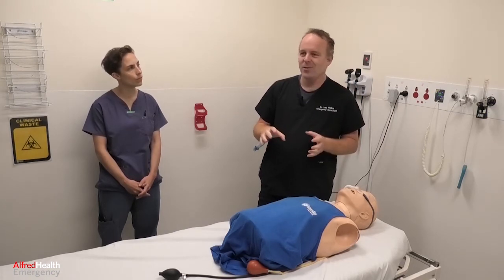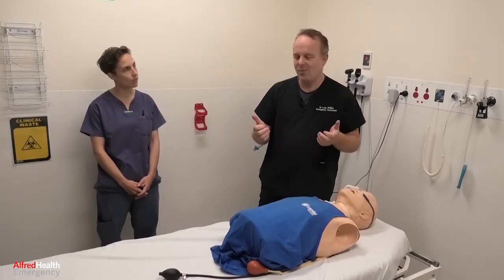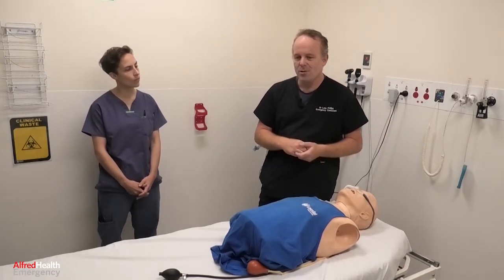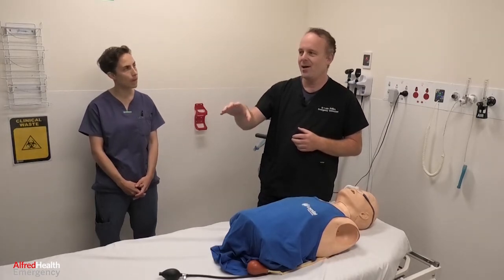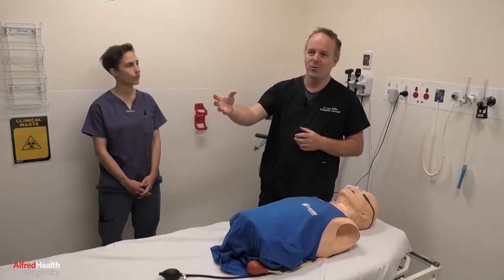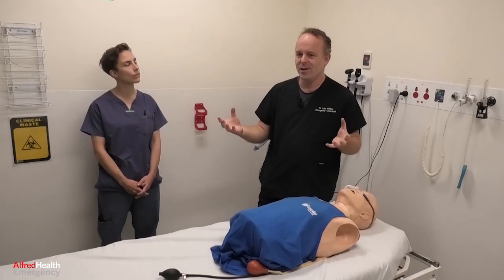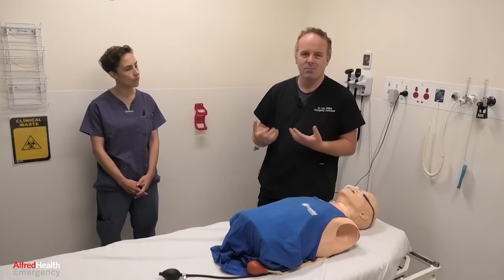The highest risk moment of the intubation is when you're bagging the patient, or putting the bag valve mask on the patient, or going anywhere within 2 meters of the airway. So ideally we set up the room outside. We set up all our equipment outside the room, in either an ante-room or just outside a room with a closed door. Ideally this should happen in resus 3, but we may be overwhelmed and may have to adapt to that. The next cubicles will be ones with doors that we can shut.